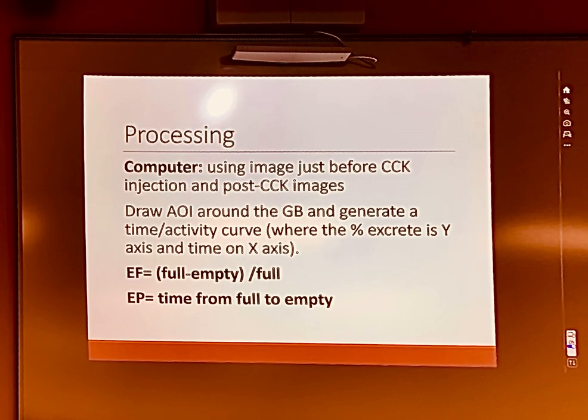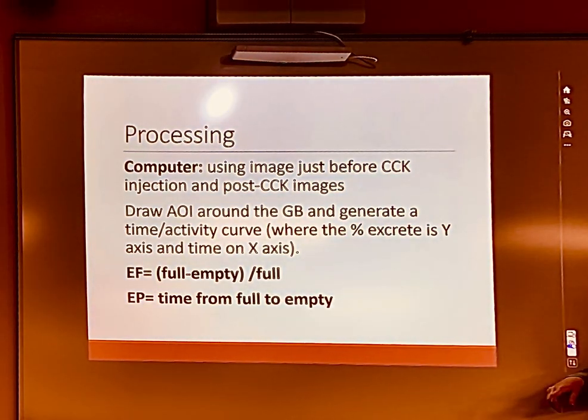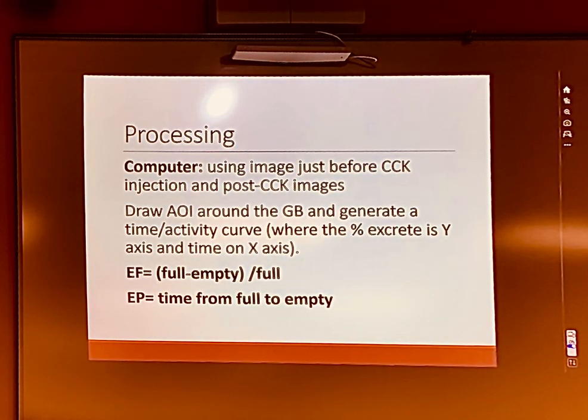Okay? It will also give you the EP, right? Your EP is the time it took you to go from full to empty. So it may say to you, your GBEF equals 38% by 30 minutes, by 20 minutes, 18 minutes, okay? Was it EF where it says full minus empty, are both of those fulls the post-CCK full?